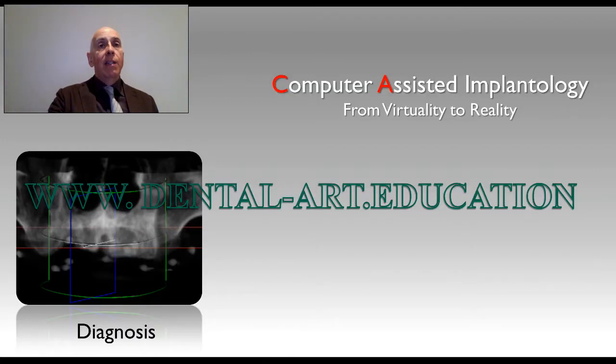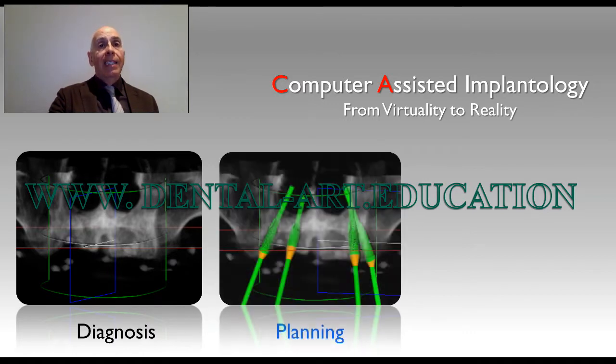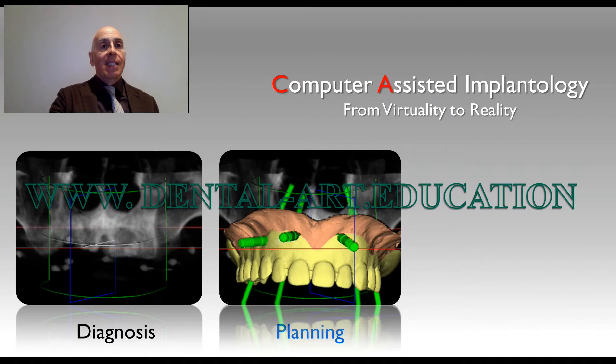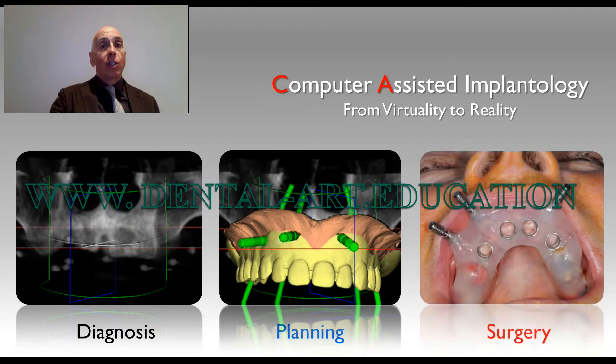Computer-assisted implantology is a complete procedure. First of all, it's a diagnostic system. After that, it allows us to plan the necessary number of implants coherent with the prosthesis design. Also, it lets us build the prosthesis before doing the clinical procedure. Finally, it permits us to do the surgical session, placing the implants through a surgical template and, at the end, to apply the immediate loading prosthesis.